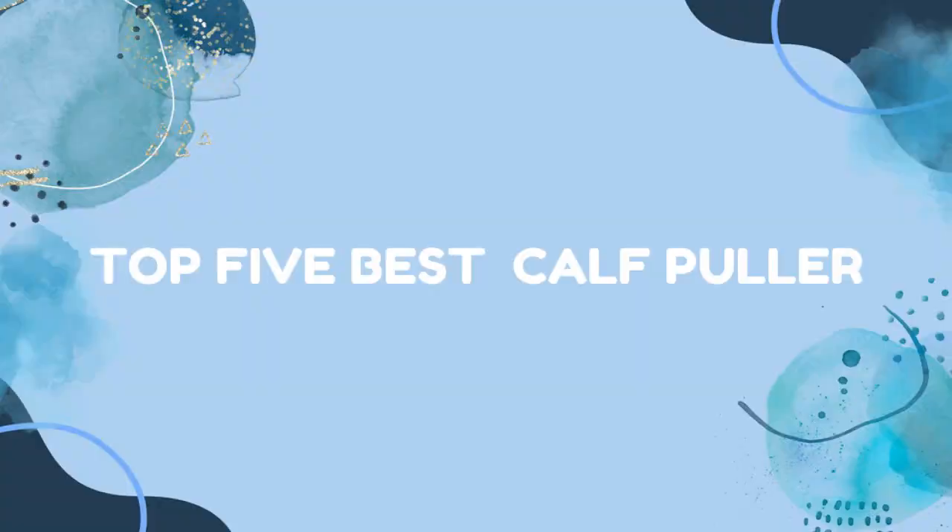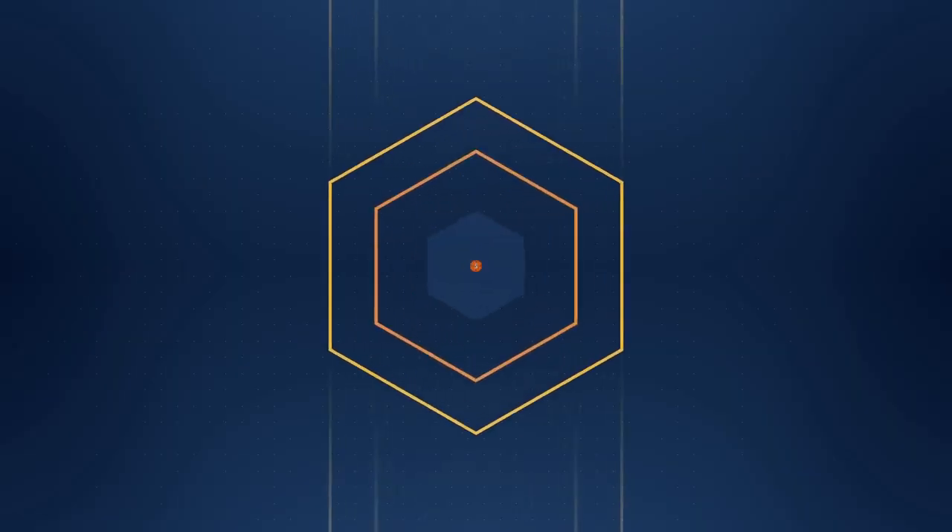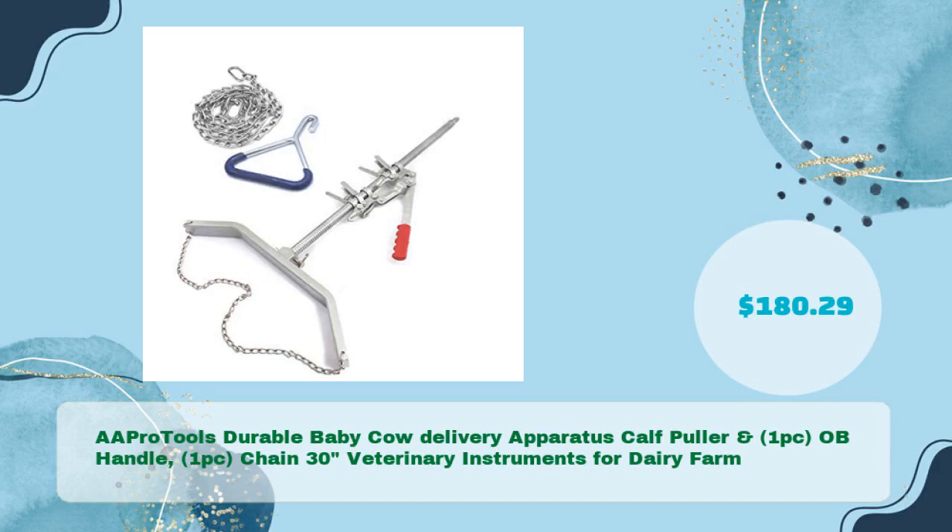Top 5 Best Calf Puller. AA Pro Tools Durable Baby Cow Delivery Apparatus Calf Puller with OB Handle and Chain 30-Inches Veterinary Instruments for Dairy Farm, available for just $180.29.